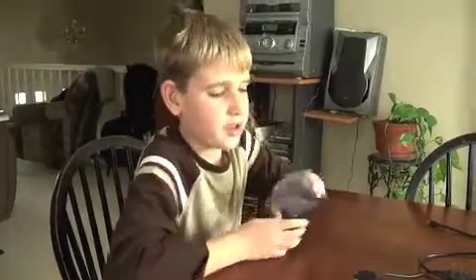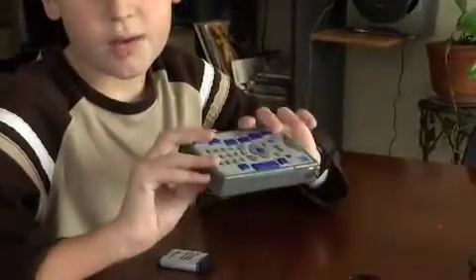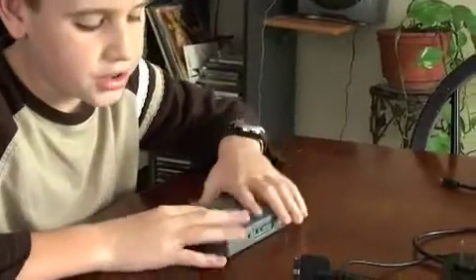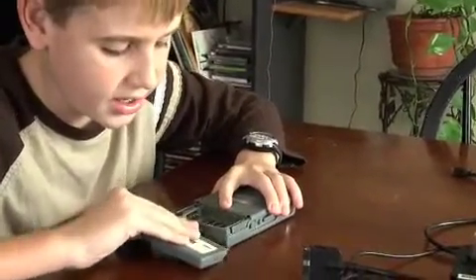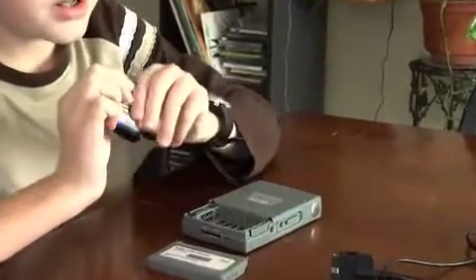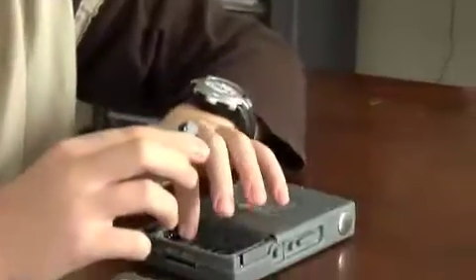When you take your BraillePlus out of the box, you'll also find the battery. There's a battery compartment door which looks like this. To find it, you'll need to flip your BraillePlus over from the button side up till it's upside down. Then push down on the bottom part and slide open the battery compartment door. Insert your battery. There's a little indentation on the side of the battery here, and there's a little thing on the side of the battery compartment, so it only fits in one way.